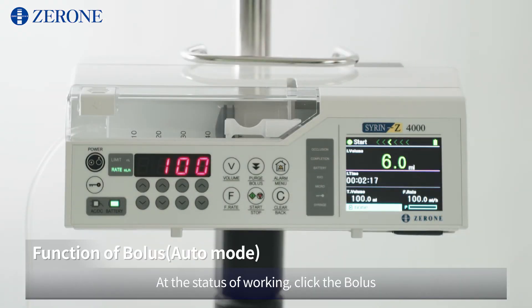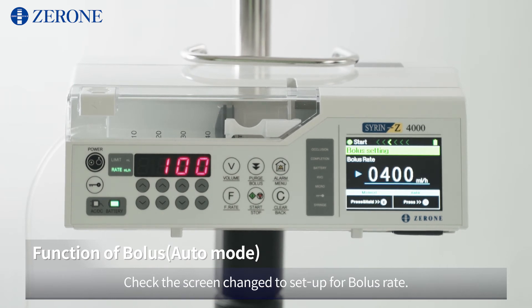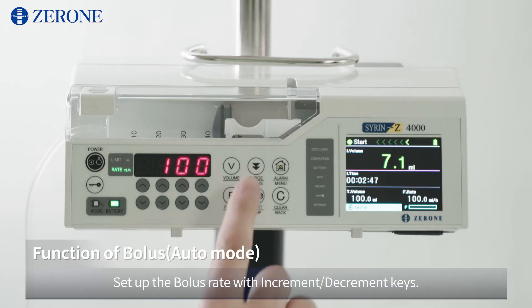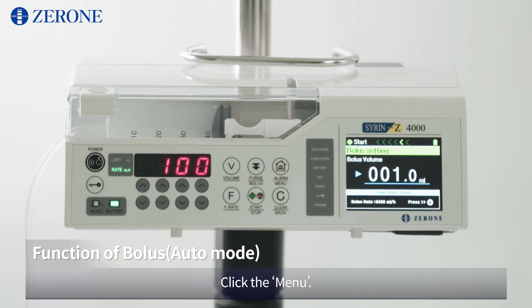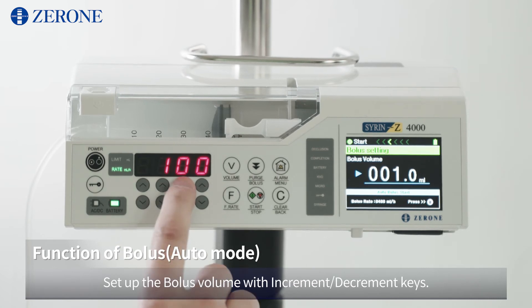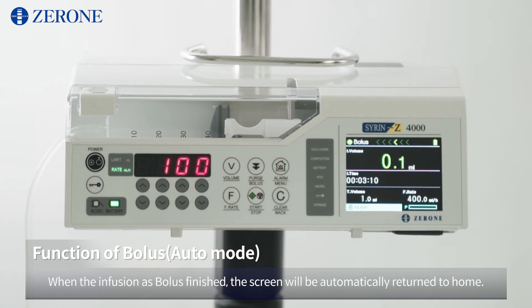At the status of working, click the bolus. Check the screen changed to set up for bolus rate. Set up the bolus rate with the increment and decrement keys. Click the menu. Set up the bolus volume with the increment and decrement keys. Click the bolus. When the infusion as bolus is finished, the screen will automatically return to home.